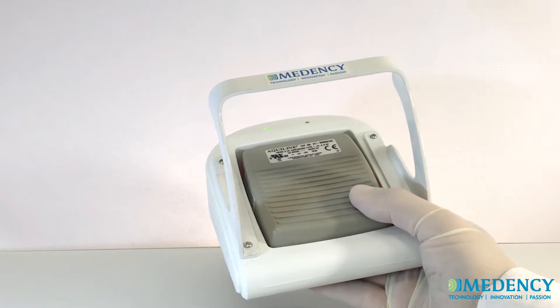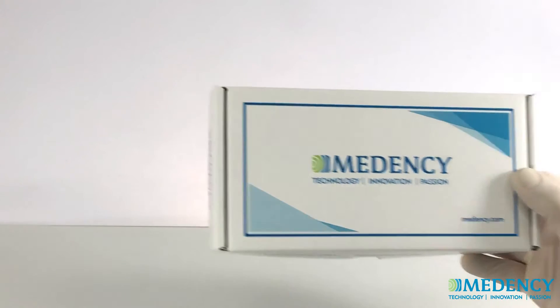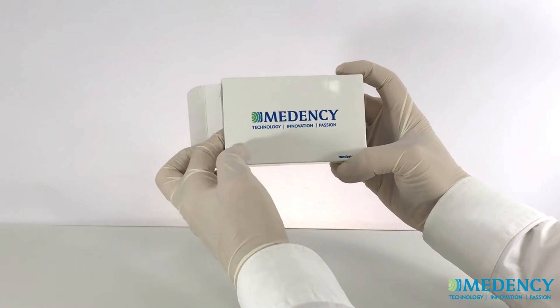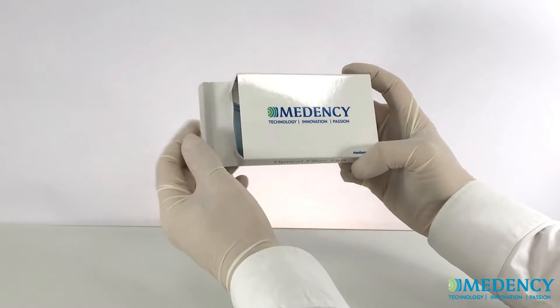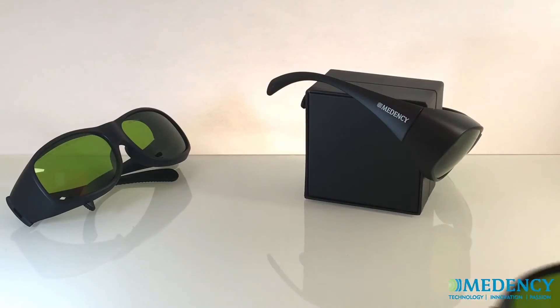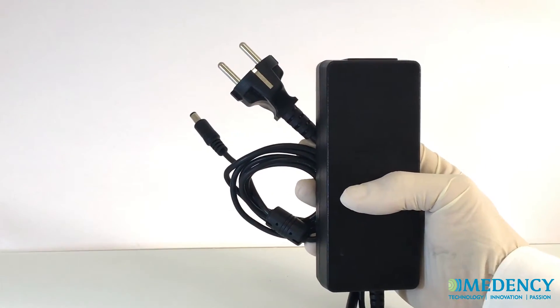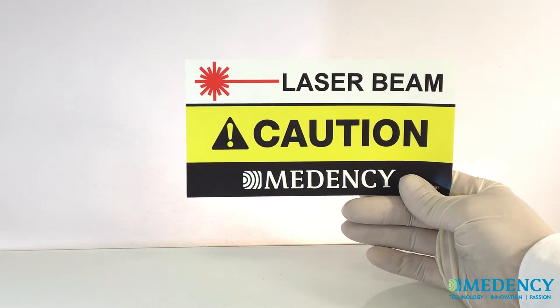The box contains the Primo laser console with the interlock system installed, footswitch, delivery system, five boxes of laser tips for different purposes, three pairs of protective laser eyewear — a pair for the dentist, a pair for the assistant, and a pair for the patient — the power supply and cord with standard plug, and the laser danger sign for your clinical workspace where the Primo laser will be used.